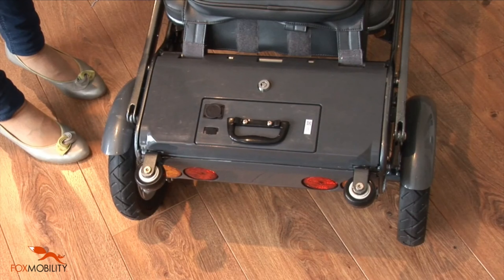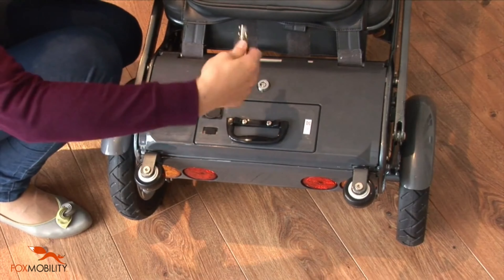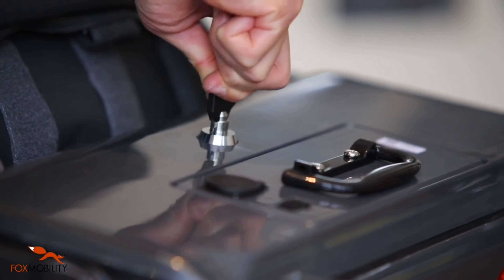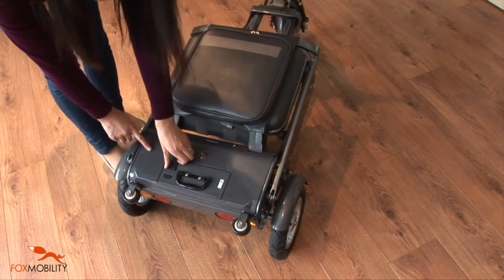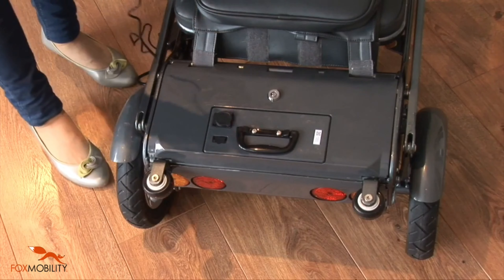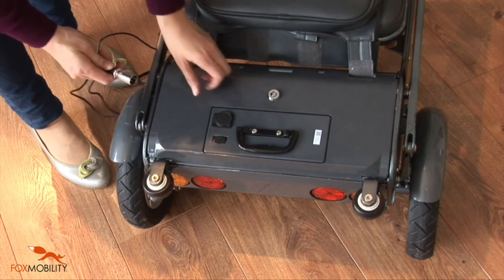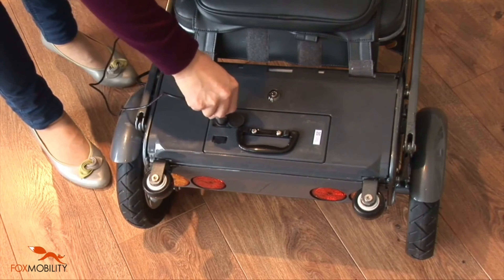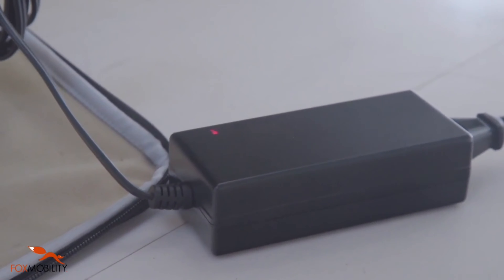To remove the battery, use the key to unlock the battery box. Insert the key in the battery keyhole and turn it clockwise by a quarter of a turn. To charge the battery, the charging port is on top of the battery. Slide to open the cover. Push in the three-pin metal connectors of the charger and then plug it into the socket, or into the eFoldie voltage converter when charging in your car. The red indicator means it is charging and will turn green when the battery is fully charged.